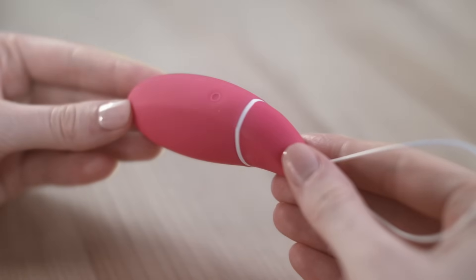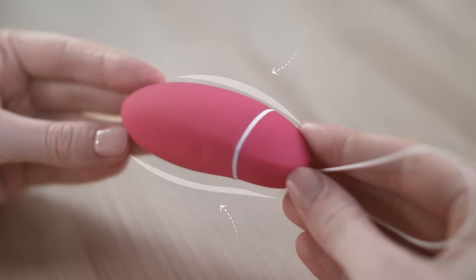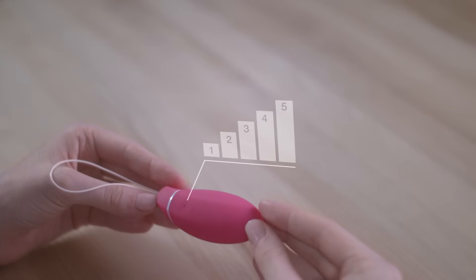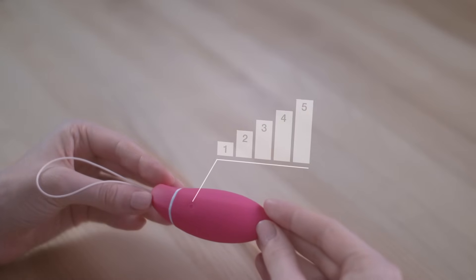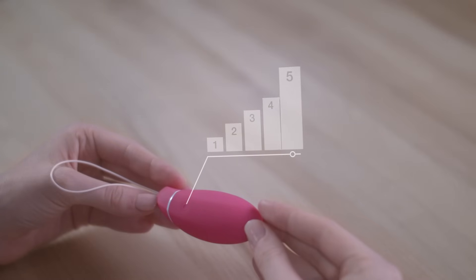Every time you exercise, Kegel Smart's patented touch sensor technology registers how strongly you can contract your pelvic floor muscles and monitors whether you're keeping up with the routine. It uses this information to automatically select one of five progressive exercise levels for your next routine. And as your performance improves, Kegel Smart will move you up through the levels to more challenging workouts. Using Kegel Smart couldn't be easier — just follow the vibrations to perfect pelvic floor health.